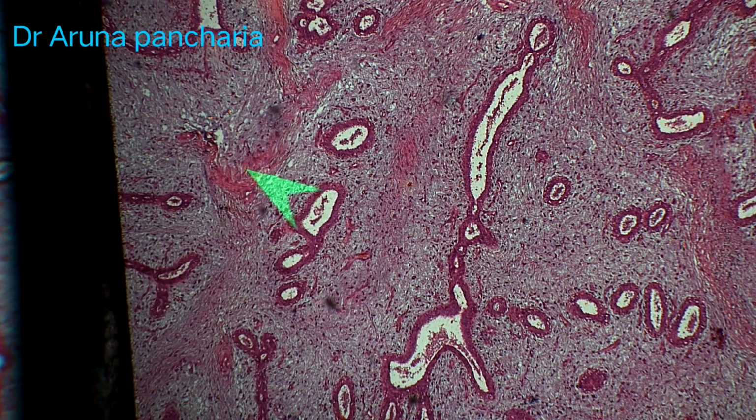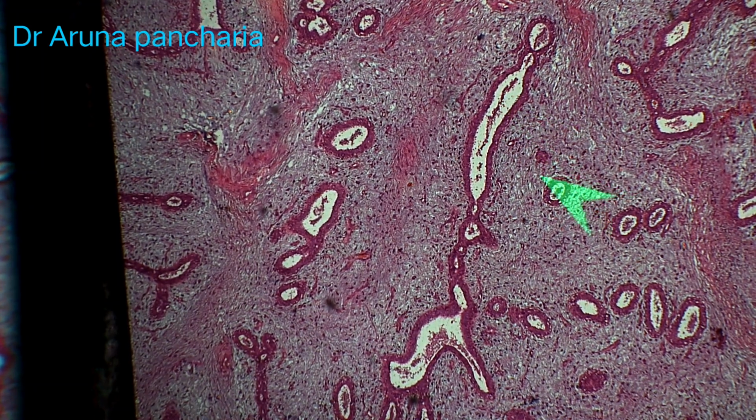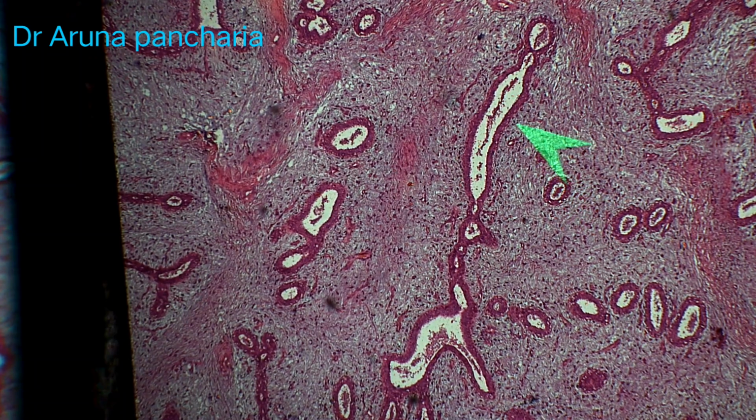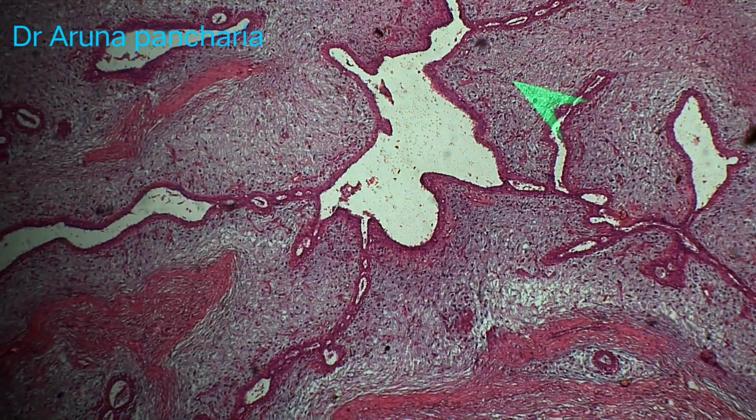There is expansion of the intralobular stroma, and you can appreciate the interlobular stroma. So interlobular stroma is dense, while intralobular stroma is loose and myxomatous, and there is a proliferation of all these ducts and acini. All these are the acini. So few acini are rounded and few glands become slit-like. So this is the typical picture of the fibroadenoma.